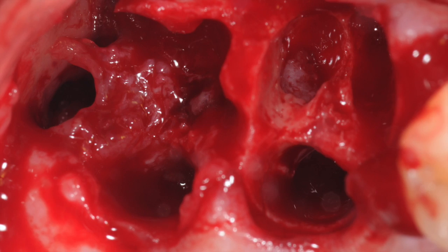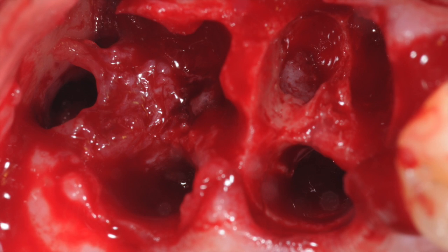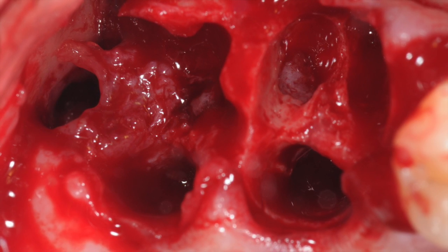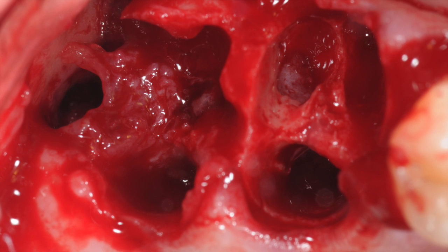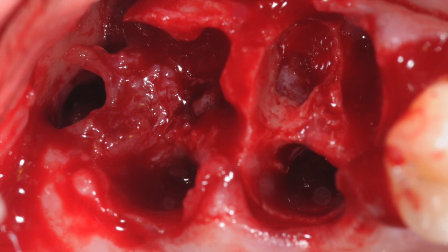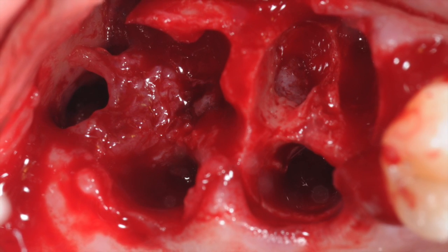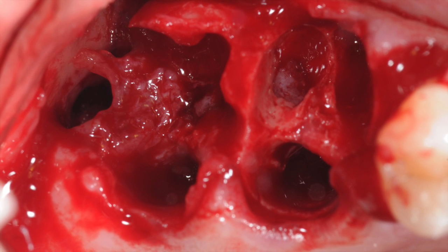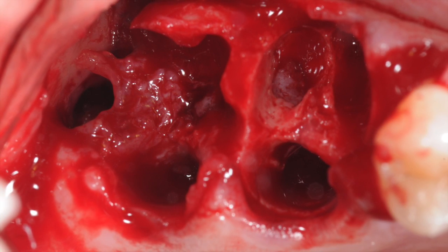Here we can appreciate the extraction site and the cystic lesion apically. While it's much easier to enucleate the cyst using the buccal window, if possible it's better to access it from the extraction site in order to preserve the buccal plate.